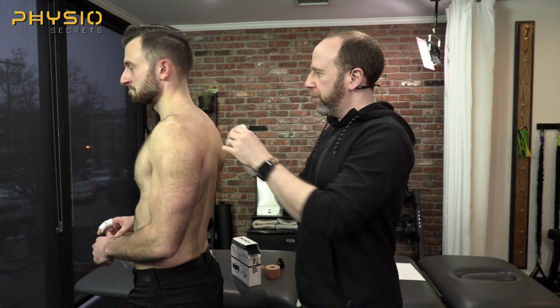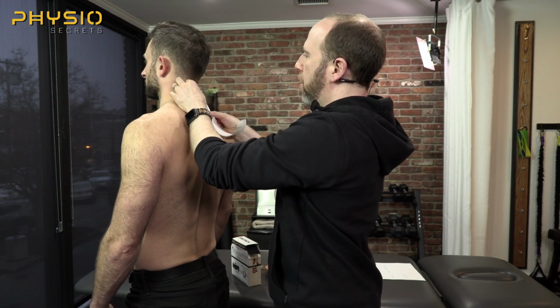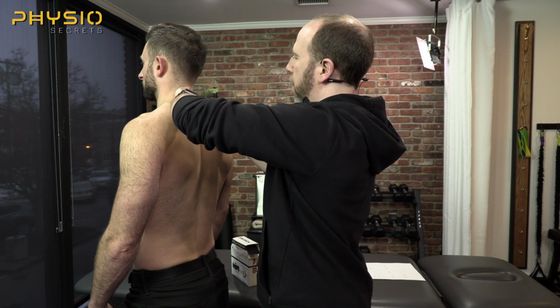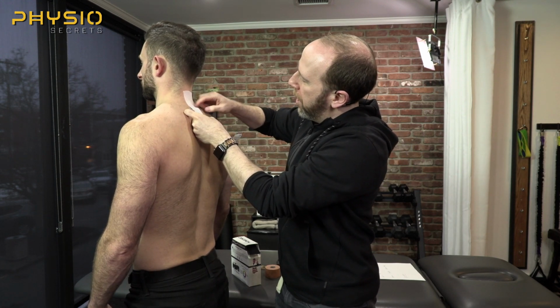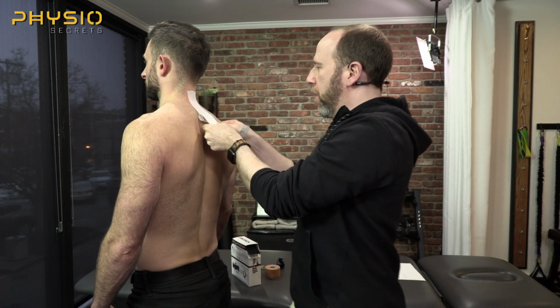All right, here we go. So look straight ahead for me. Good. I'm going to go in the same exact spot I did before. There's my anchor. Okay, again, I got a 2-inch anchor. I'm going to try to heat the edges of the tape up a little bit just so I make sure that they stick really nicely. I'm going to peel this off.